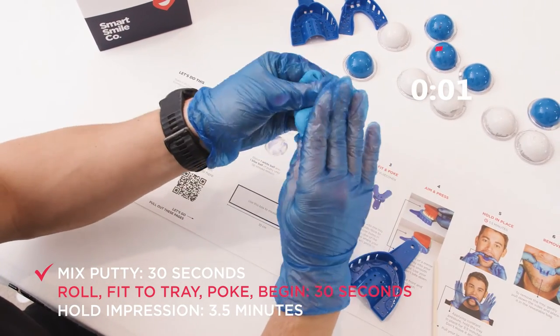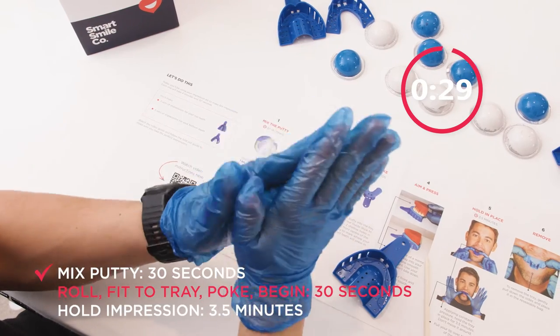3, 2, 1. Roll the sausage and check the size.